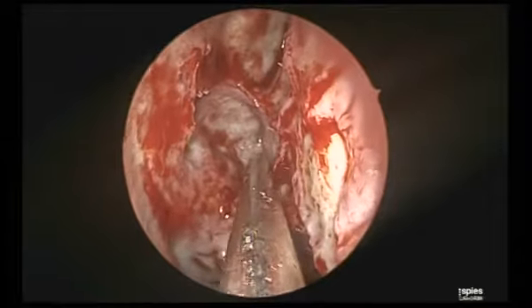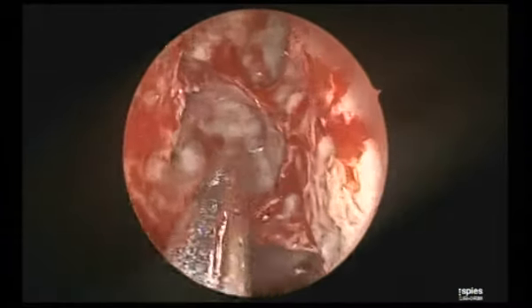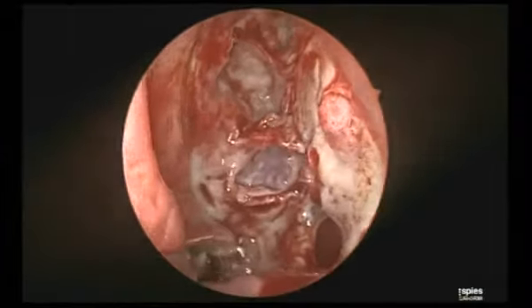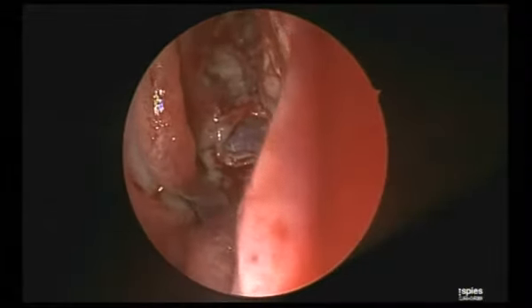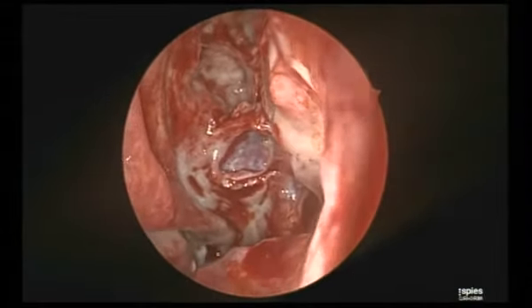If anybody is finding difficulty, if there is too much disease there and you are scared of the anterior ethmoidal artery, just find the ground lamella, see the upper attachment, and the anterior ethmoidal artery is almost always immediately anterior to it. This relationship is never going to change. The relationship of the supraorbital cells and other things is variable. To me, if you ask the single most important landmark for the anterior ethmoidal artery to be identified during surgery, it is this.